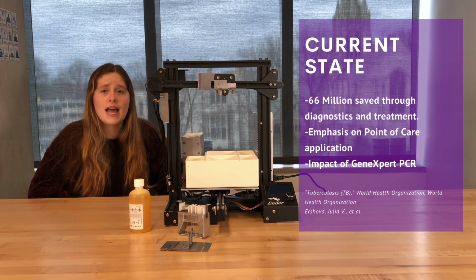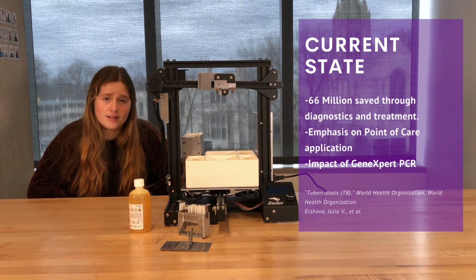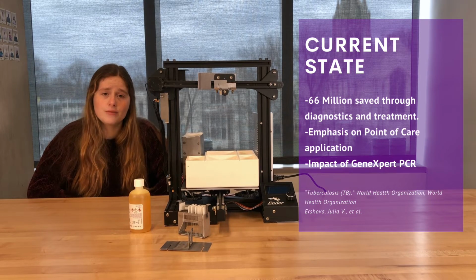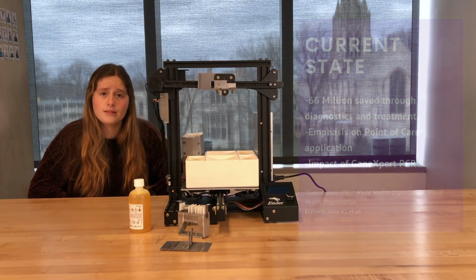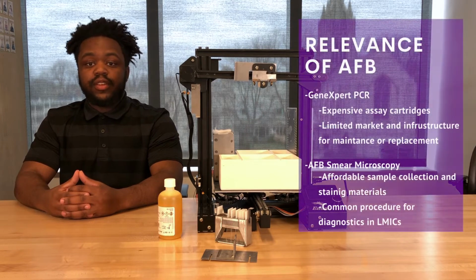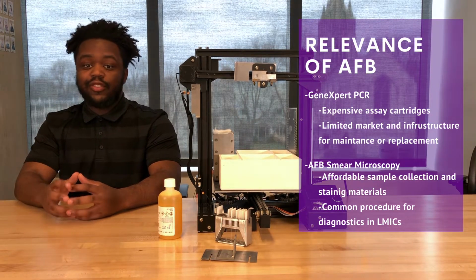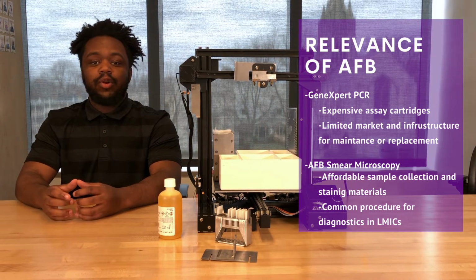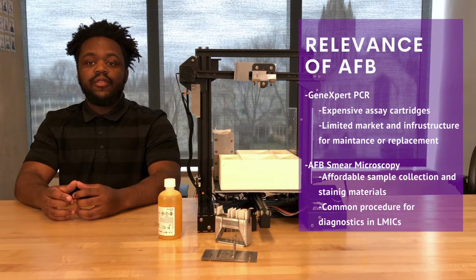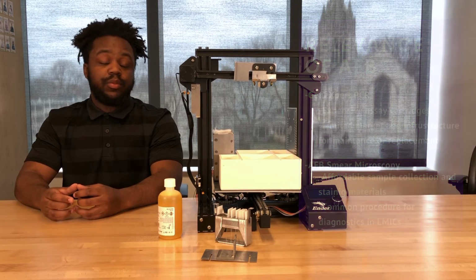Advancements in nucleic acid amplification systems like Xpert and other diagnostic systems have revolutionized testing for tuberculosis, especially in point-of-care rural community settings. The acid-fast microscopy method has a lower sensitivity and specificity than the GeneXpert system, but it is also significantly less expensive and more commonly used for initial diagnostics for the most infectious patients and for testing the disease progression through treatment.